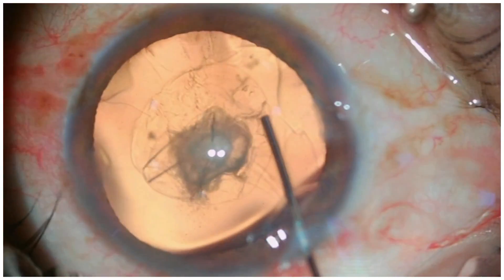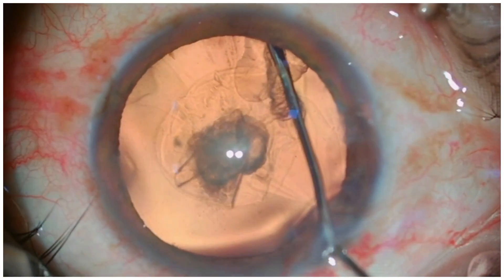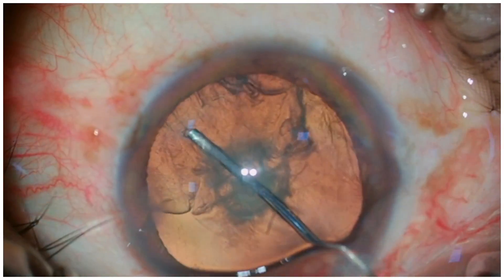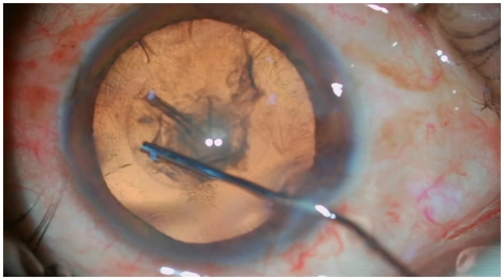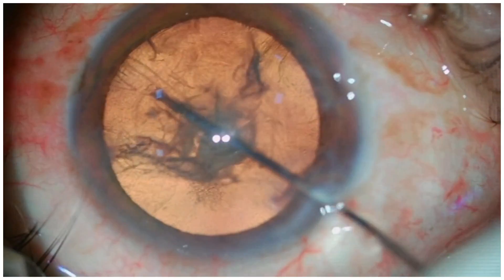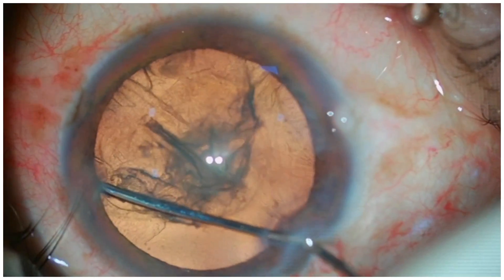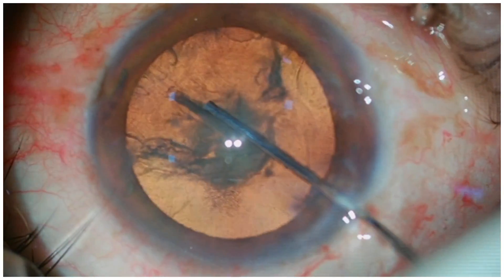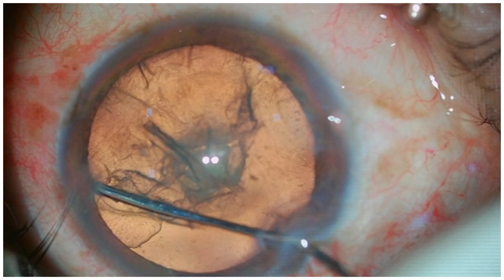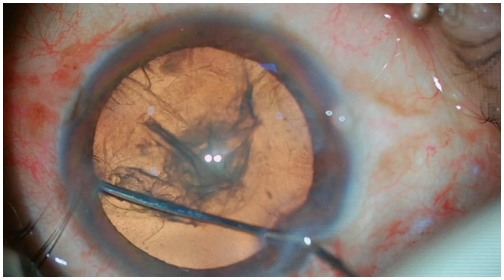You can see a small CCC soft cataract with hydrodissection being made here. The anterior chamber deepens, and then you can see that the posterior capsule just gets ruptured. When it opens, you can see that the pupil constricts a bit — this sign is called Pupil Snap Sign.